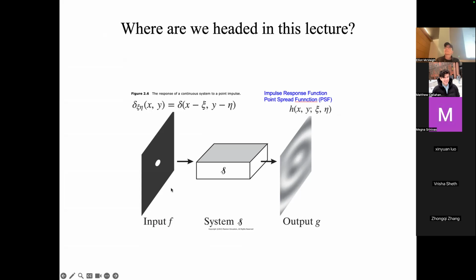Another way of doing this is like if I have that ball bearing and I put it in the scanner, and I take a look at that mathematically, that's my ground truth input object. And then I run my scanner and I get an output for that ball bearing. So this is what's displayed on my scanner after all the sampling and reconstruction is done. I get something that looks like this. So I know what this is if I'm testing the scanner. We don't know what this is when we're imaging somebody. We're trying to figure this out, right?